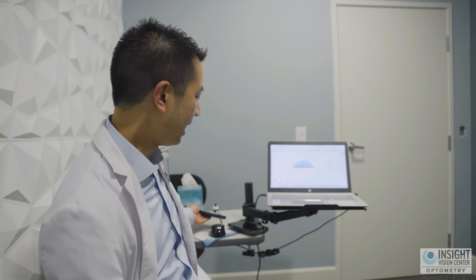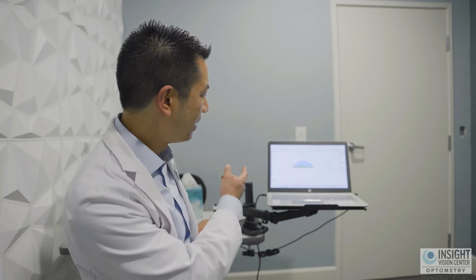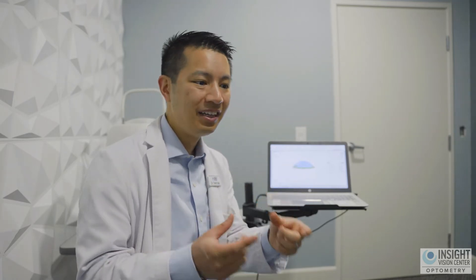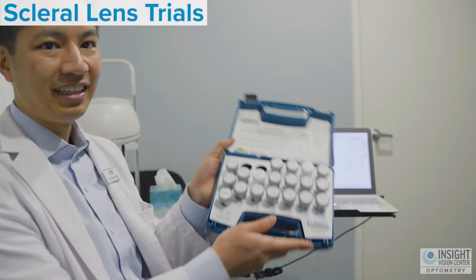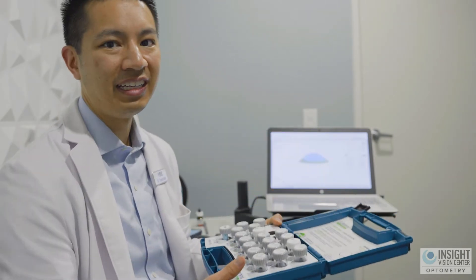The next step is to determine what prescription you need in your scleral contact lenses, because taking a picture of the eye doesn't tell you your prescription. So the next step is to actually get a scleral contact lens and put it in the eye. Your doctor will use a fitting set and grab a lens that matches your eye somewhat closely.